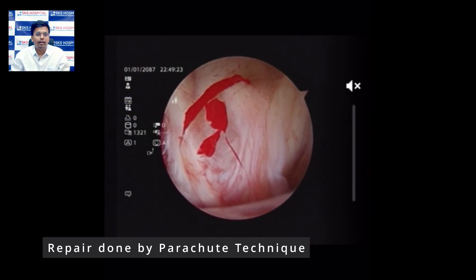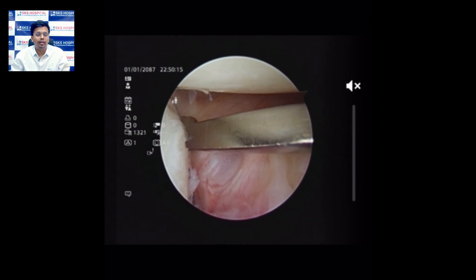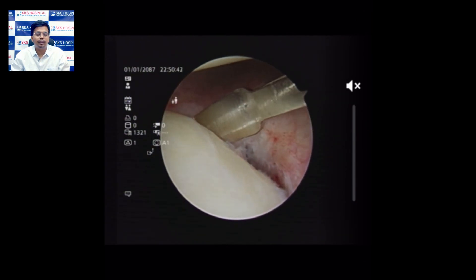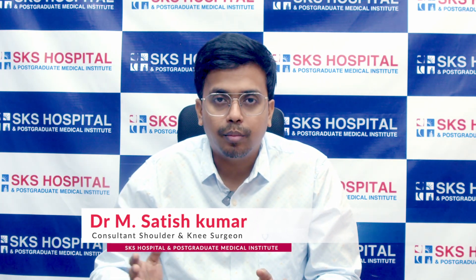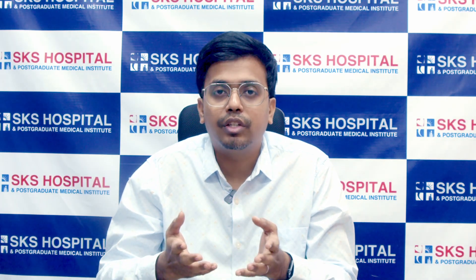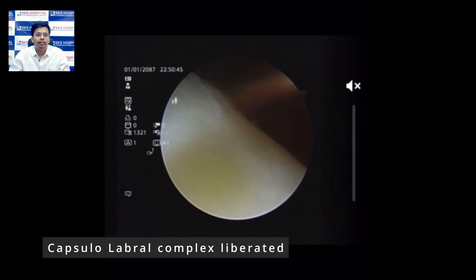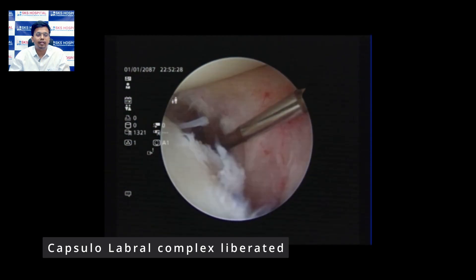We pass the liberator through the antero-inferior portal, positioning it exactly at the interval plane between the glenoid and the capsulolabral complex. We then mallet the liberator to liberate the capsulolabral complex. An important note: the liberator must be kept precisely in the interval plane. If it is not kept in the exact interval and is malleted through the capsulolabral complex, there is a risk of tearing or shredding it, which would result in an unsatisfactory repair. The fresh bleeding seen as we mallet confirms we are in the correct interval.